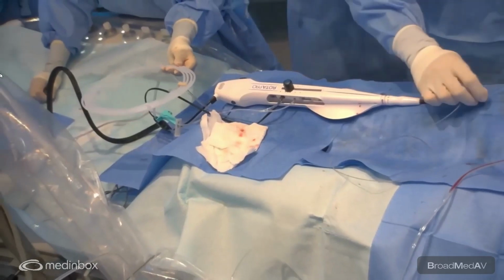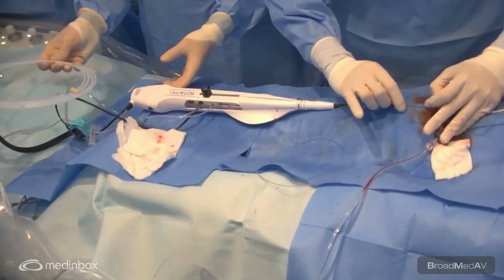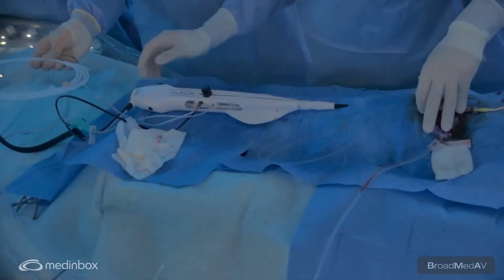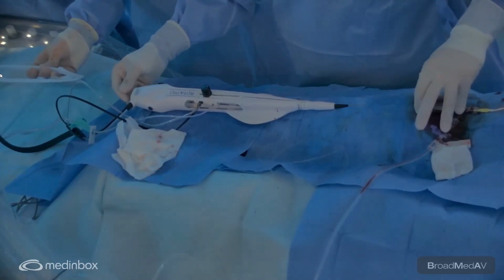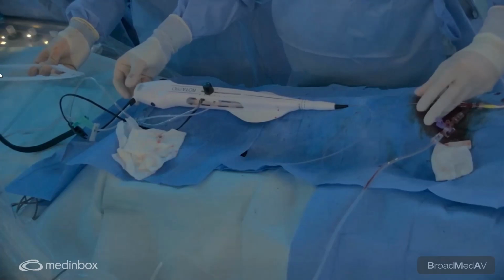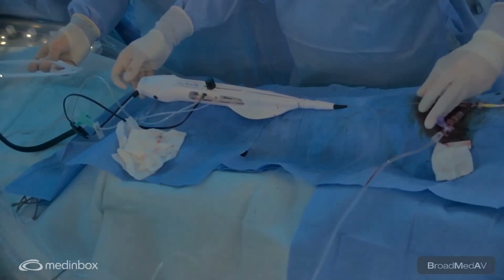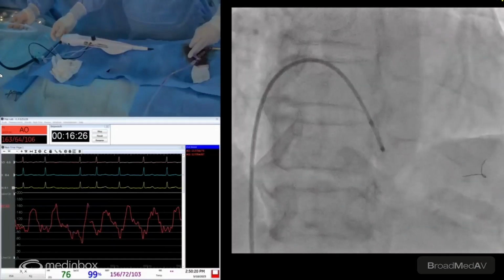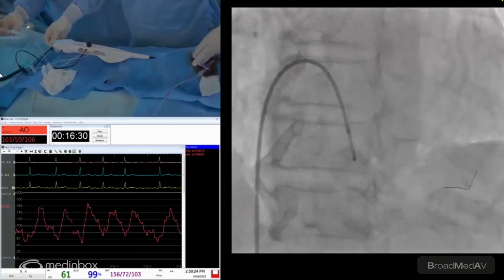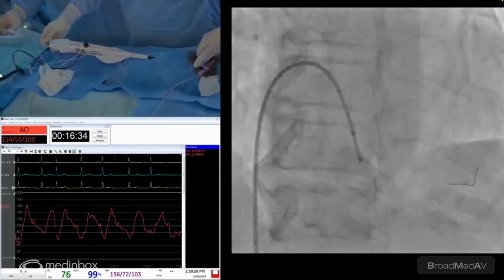Okay, so again, I'll show you a second time, the one-man technique. You insert the burr, make sure you have flow on everything. And then here you go. Watching both sides. So it might be a bit confusing at the beginning because you're operating both hands at the same time, but once you get the hang of it, you don't go back. Makes things much easier.